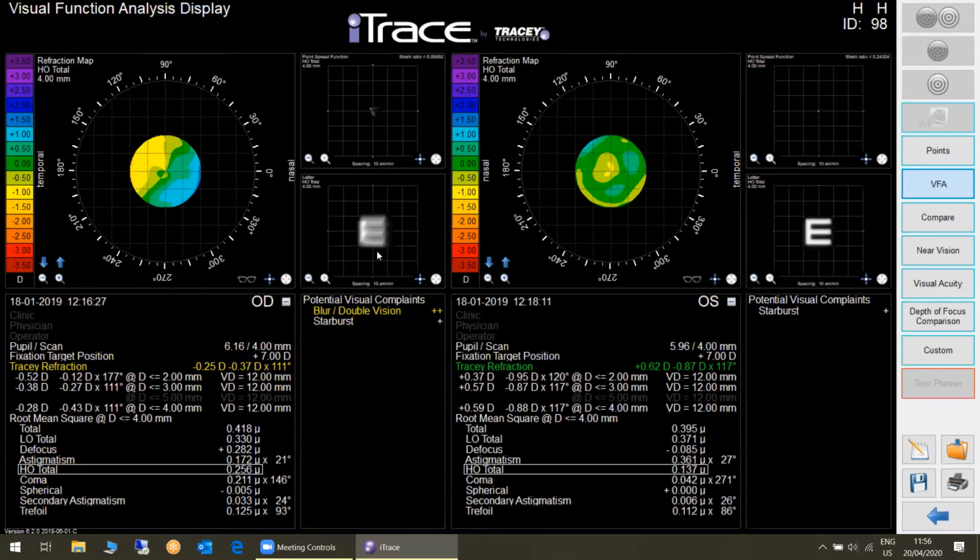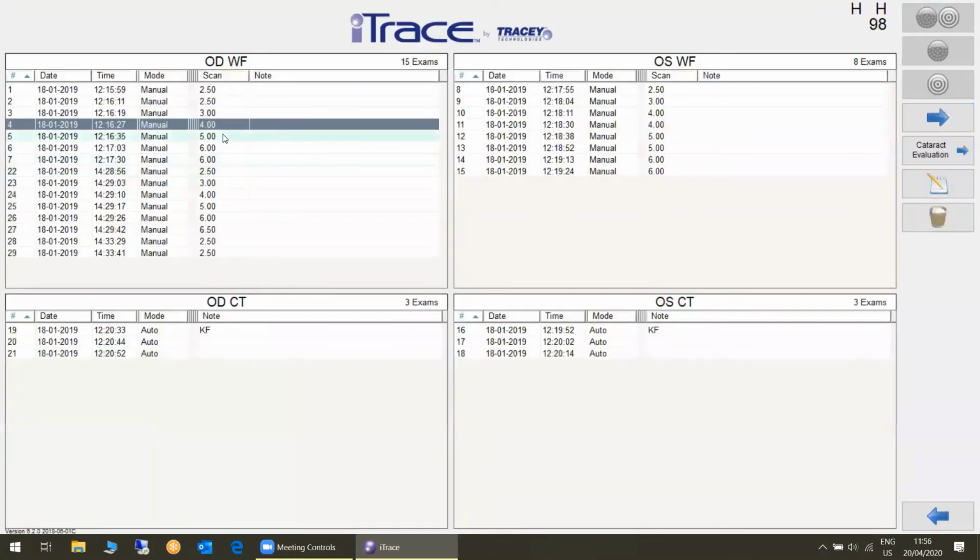And it's just that he did not understand that this is what she's seeing. It's like they are skiing in snow or in nebula. It means you just can't have your equilibrium. This is high and this is low. So I think that I know that the lens is tilted.